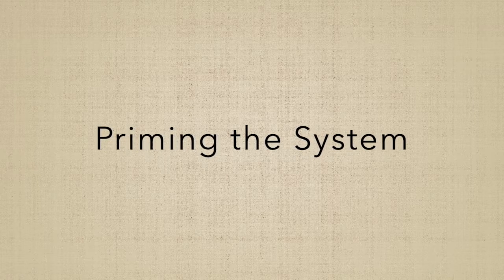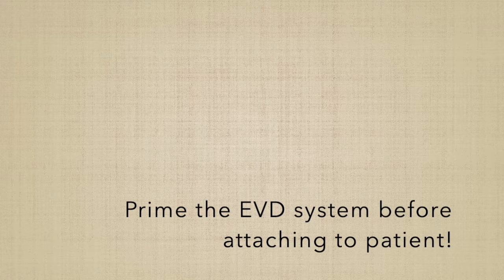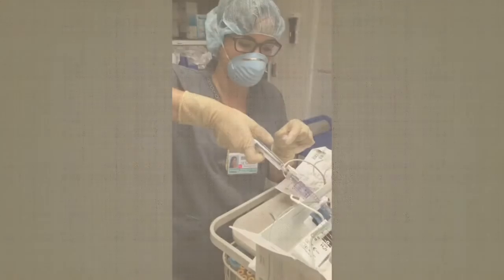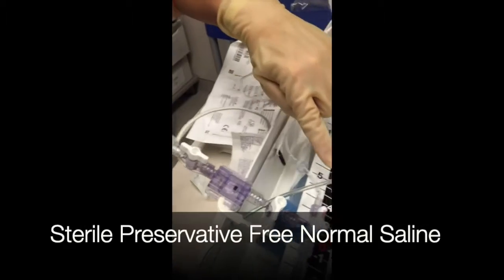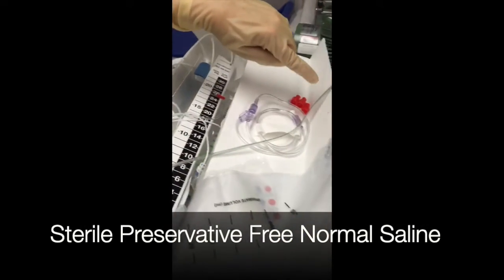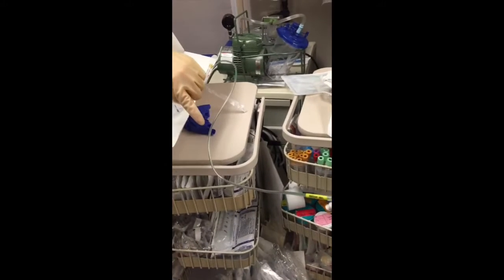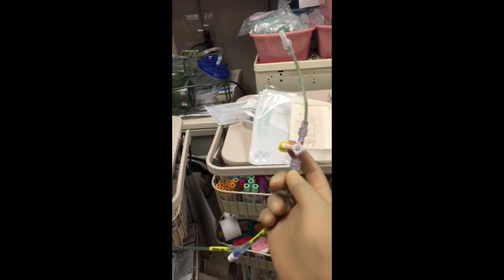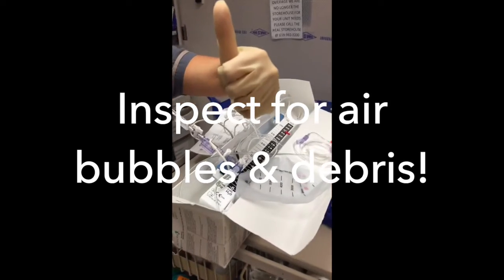Priming the system is done prior to attaching the tubing to the ventricular catheter — in other words, prior to connecting the system to the patient. With sterile preservative-free normal saline, prime the tubing from the pressure transducer first towards the tubing that will be attached to the patient, and then toward and all the way to the burette or EVD drip chamber. Inspect the line for air bubbles and debris.